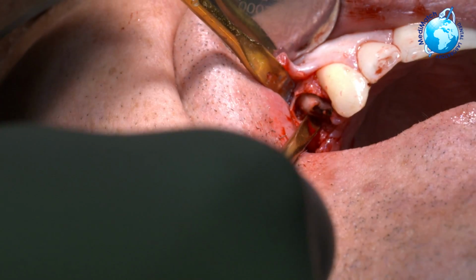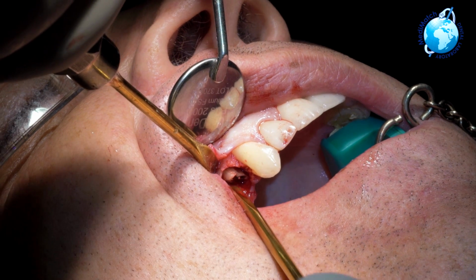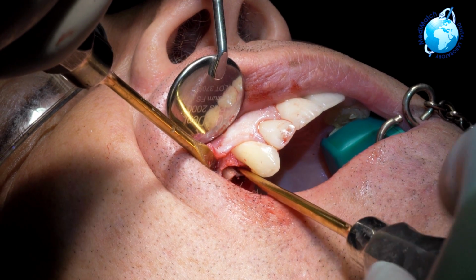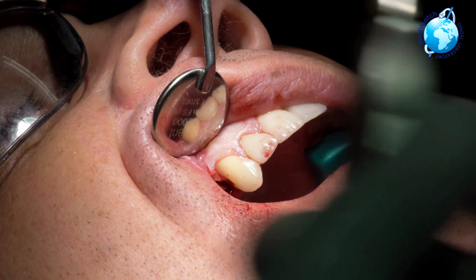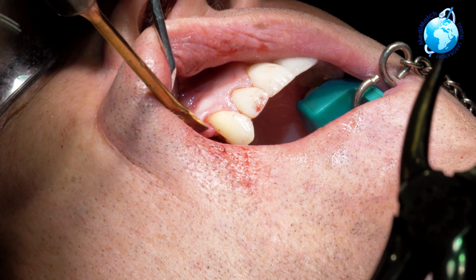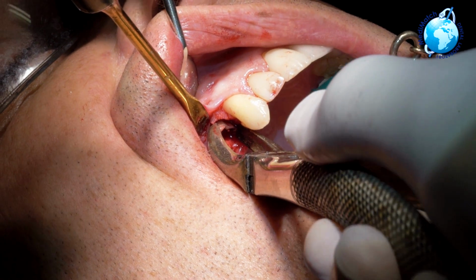Slowly but surely into this socket, slowly manipulating that root still there, till we should technically be able to deliver it now, but we'll see how we go. Note the most important thing here is we're keeping that buccal plate. We need that. It just helps.